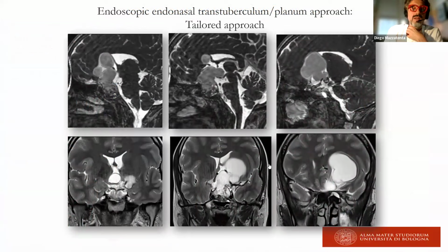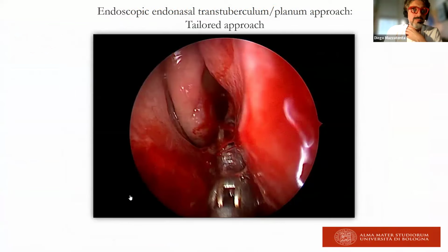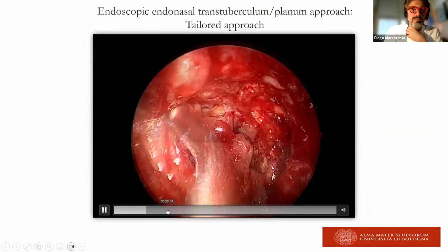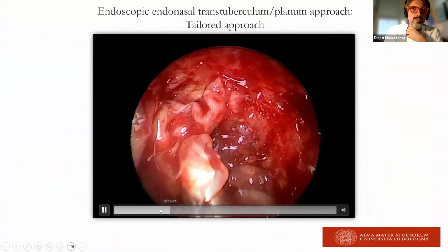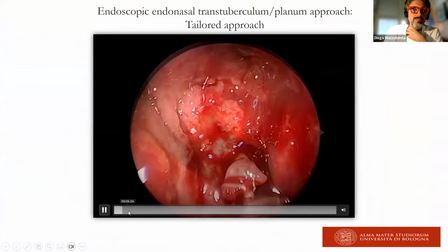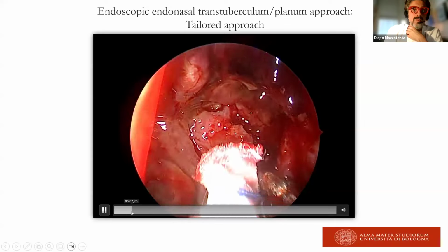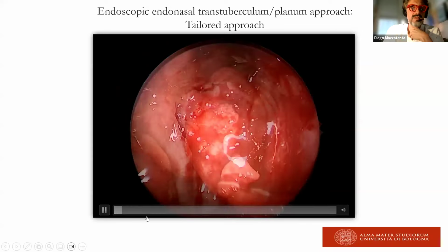This is a large case of craniopharyngioma treated with an endoscopic endonasal approach. I would like to show you only the closure, sorry. We prepare the pedicle flap.